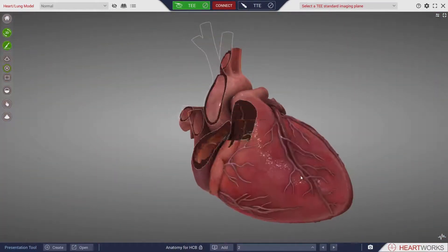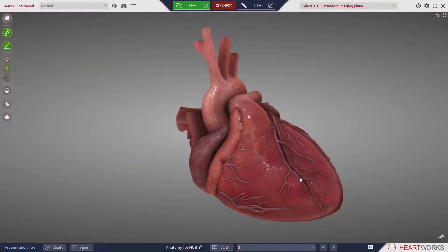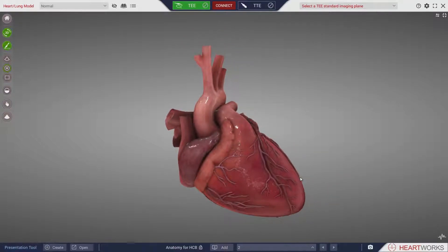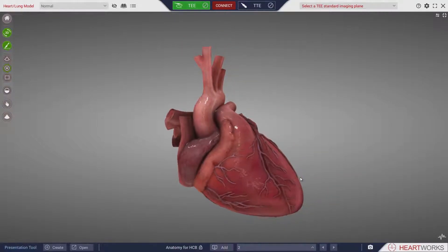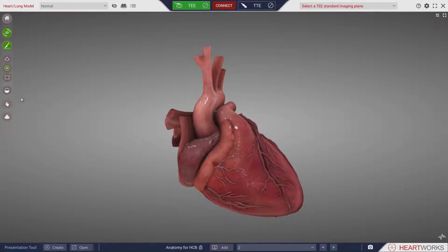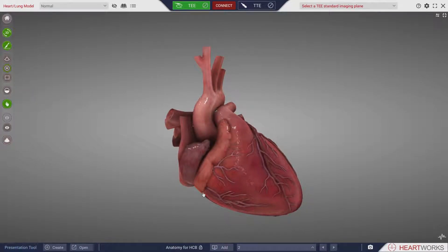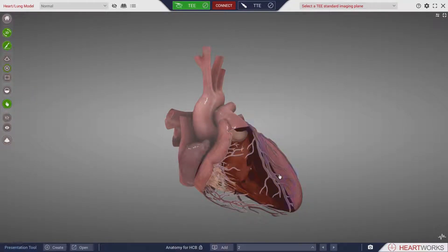As well as slicing the heart to reveal the interior, certain components can be removed to reveal underlying structures, giving further insight to anatomical relationships.